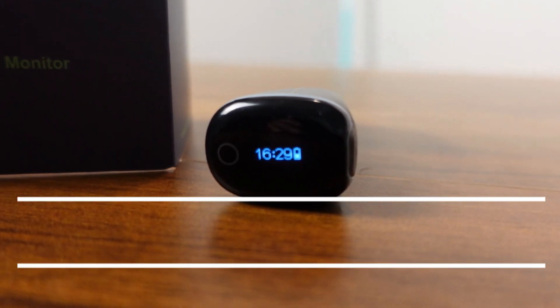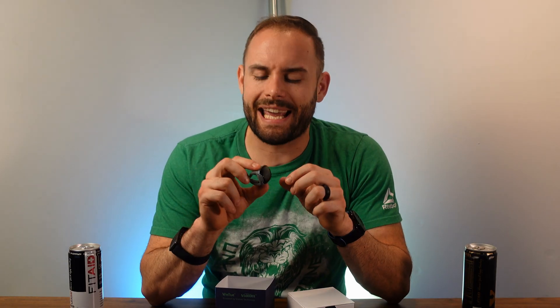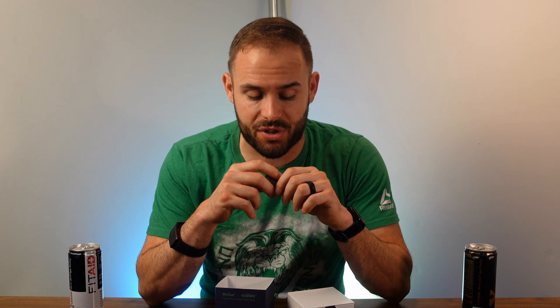What up everybody, welcome back to the channel. Today on Fitness Tech Reviews we're going to be going over the Wellview O2 Ring. This is a smaller ring built to help you out with your sleep, but let me go into its pros, its cons, and see if it's something that's right for you.